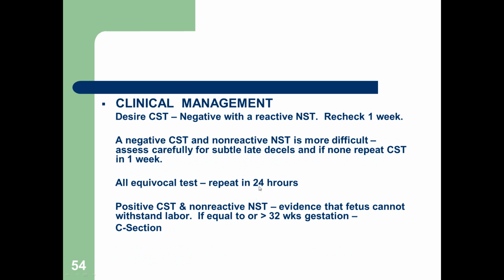Okay, clinical management. Desire a CST that's negative with a reactive NST. That's desirable. Recheck in 1 week. A negative CST and a non-reactive NST is more difficult. You're going to have to assess carefully for subtle late decelerations, and if none, repeat the CST in 1 week. Okay? And all equivocal tests, if you're unable to determine, you're going to repeat in 24 hours.